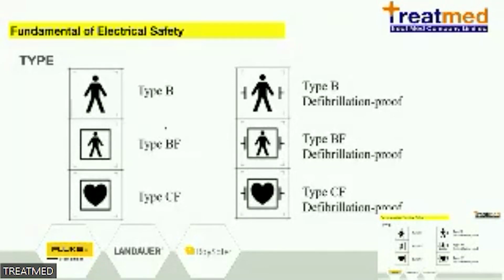Yeah. The left side and right side are different for the defibrillation proof. Defibrillation proof means that when we use the medical device and a defibrillator together, the device cannot be damaged by the defibrillator, because the defibrillator has high voltage, high current, and high energy.